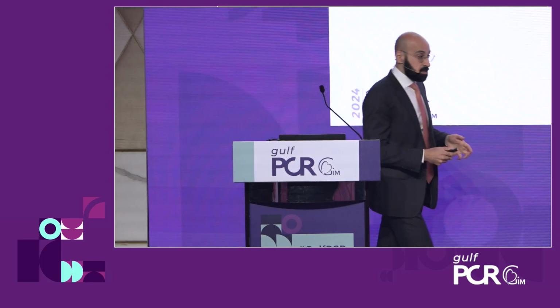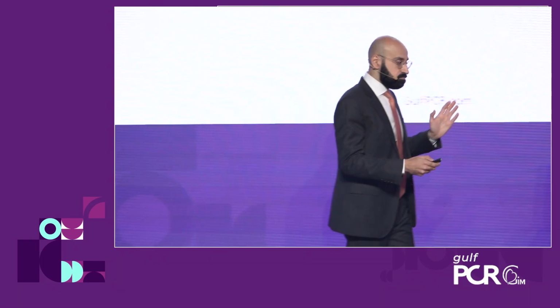Okay, so I'll be talking about short-term and long-term outcomes of ACURATE neo2. It would be very prudent to mention or touch on the ACURATE IDE trial, whose results were surprising to us, and they were released at TCT.